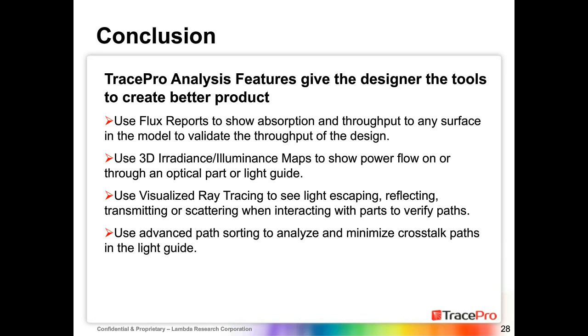Finally, you get to see rays tracing from the LEDs through the system to the photodiode. And that gives you a lot of information on where you're losing power. You're seeing if you're actually getting the bulk scattering that you expect. You get to hopefully see that banana trajectory that you expect to see there. And if you have external stray light sources or stray light inside the mechanism, you can see that occurring with this visualized ray tracing.